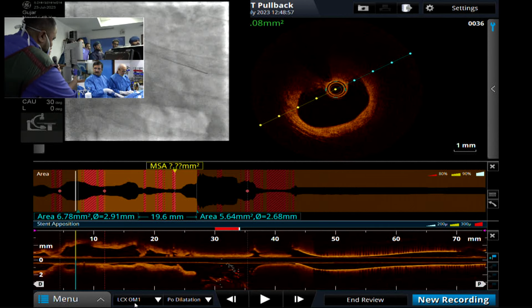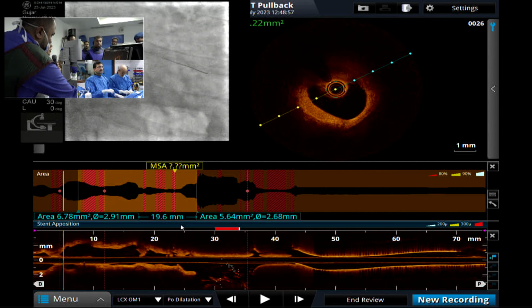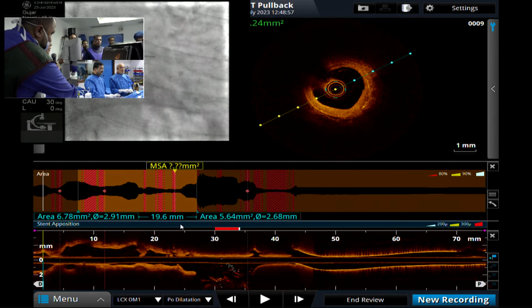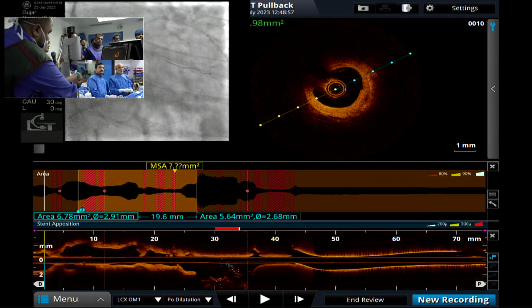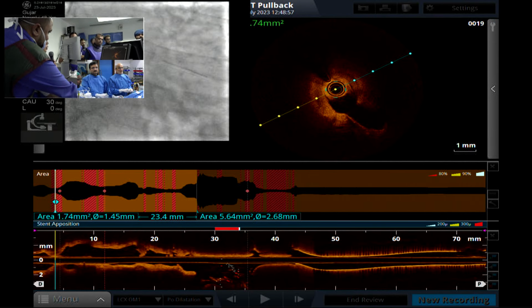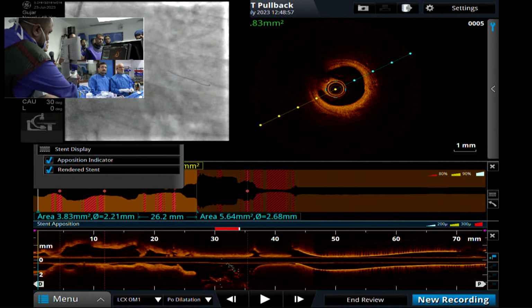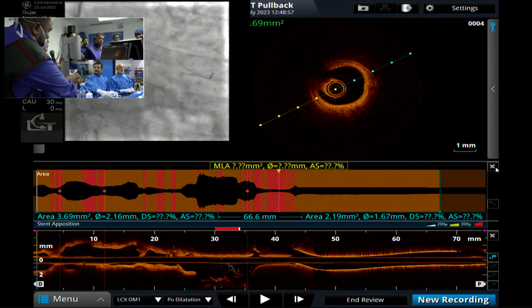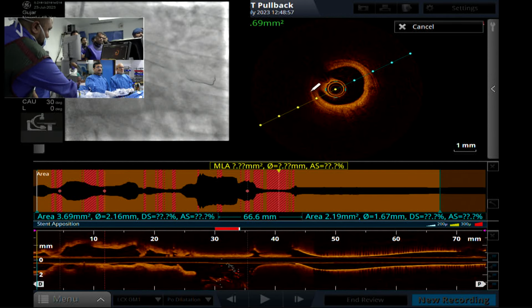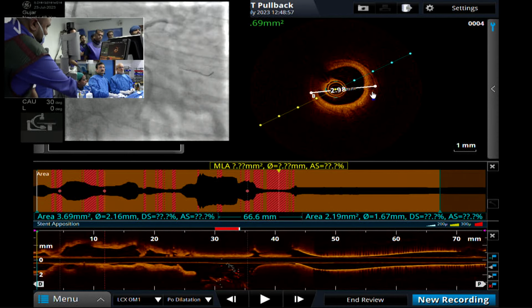Distal is about 3, right? Therefore, I think 3.25 should be okay. And additional disease in the distal side. So you try to cover everything, right? I think so, by only one stent. So distal diameter should be 2 point... Okay. Really good. Contrast up. And 3, right?